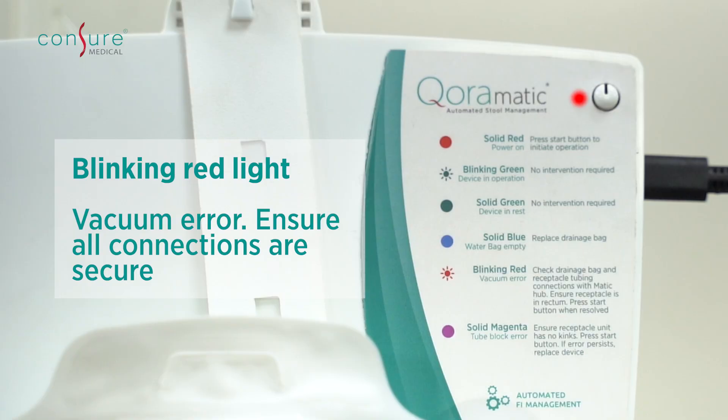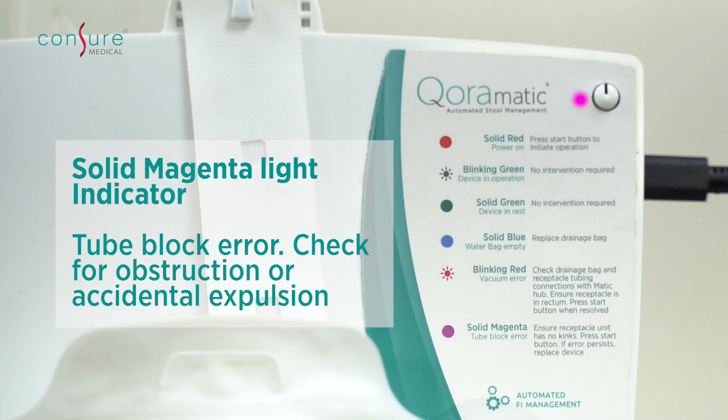Blinking red light indicates a vacuum air error. Magenta light indicates a tube block error. Unplug and replug the device to resolve.